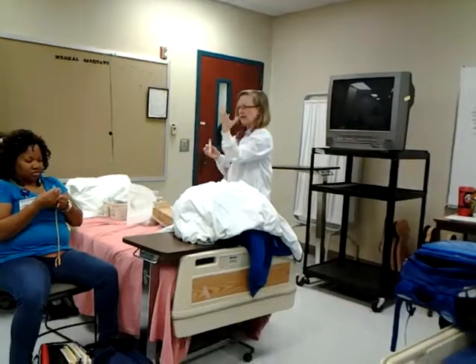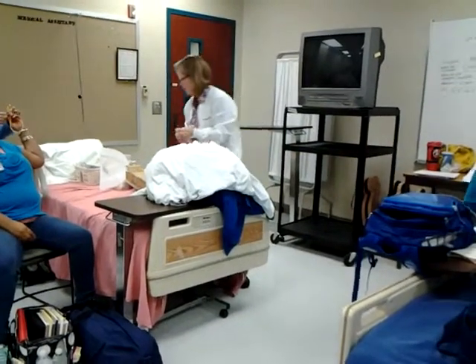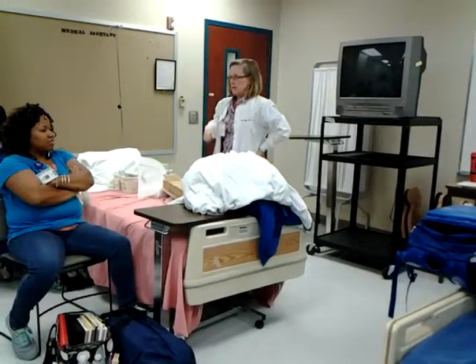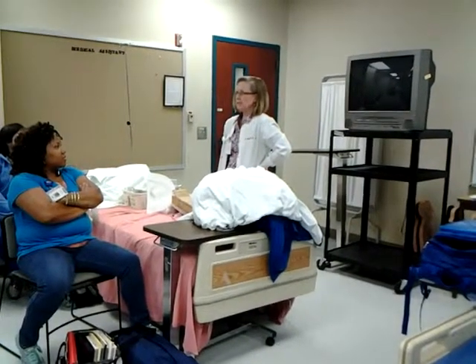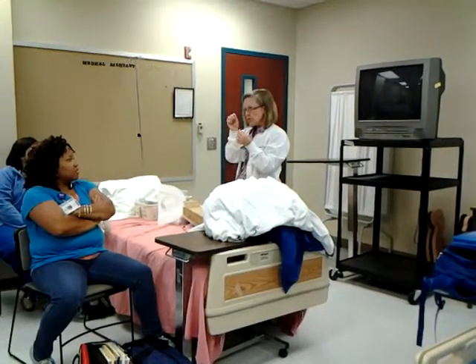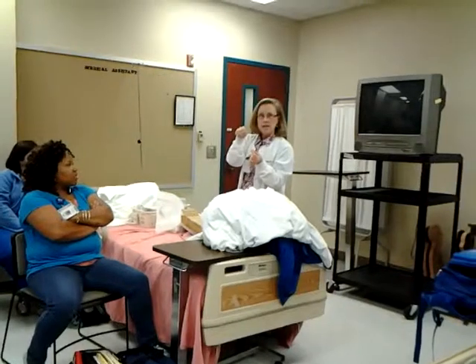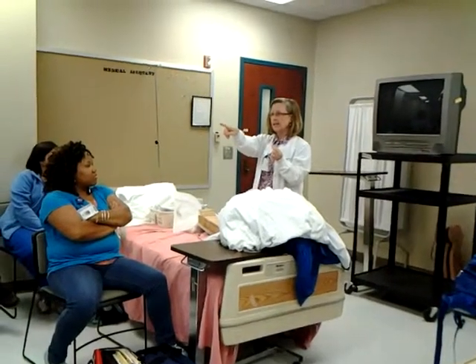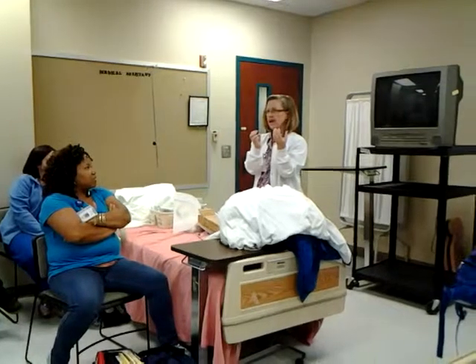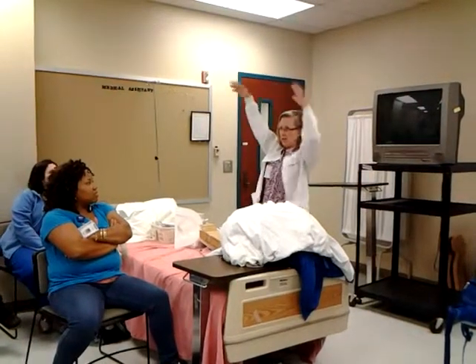When we put a catheter in a female, you go in 2 to 3 inches. Once you see urine, you go in another inch — to clear the sphincter, so you're not inflating the balloon in the neck of the bladder. That would hurt. I've seen that happen in a male patient and there was a lot of bleeding — blood shooting up and clots this big.